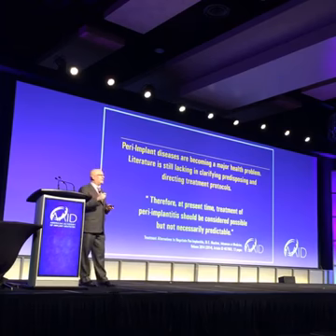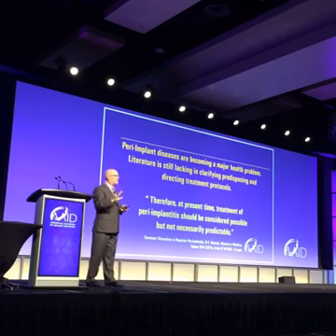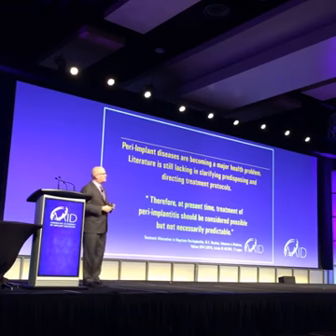But he also advocated using a diamond burr and shaving down all the threads, right? The ones that aren't covered with bone, shave down all the threads. And then polish it up, and then put a bone graft on, put a membrane on, suture it over. Hey, we're done, we treated our peri-implantitis.